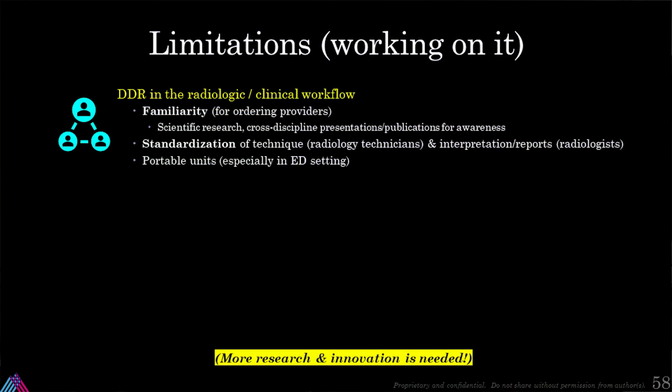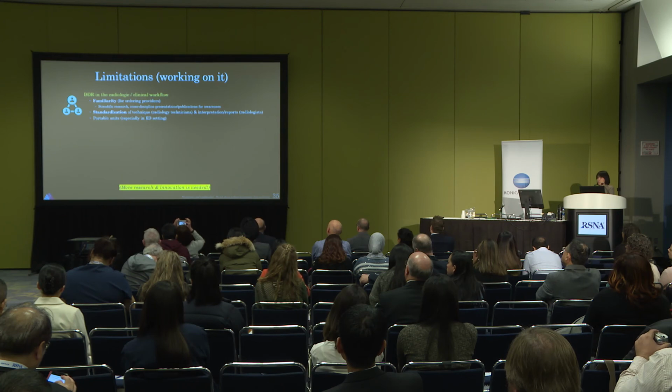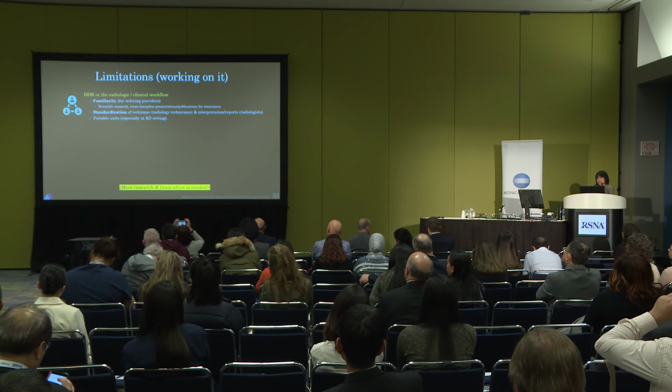So the limitations of dynamic digital radiography are that it's very new. It's not integrated into the radiologic or clinical workflow yet. So there needs to be more familiarity for ordering providers. There needs to be more research and cross-discipline presentations and publications for awareness. There needs to be standardization of that technique.